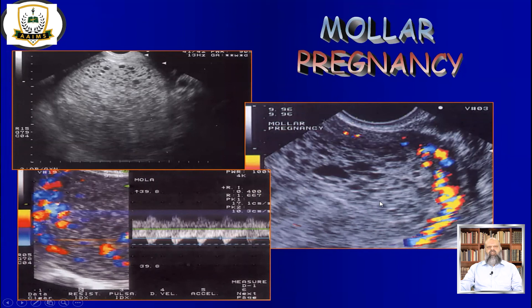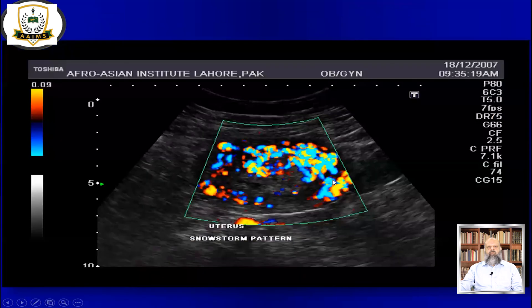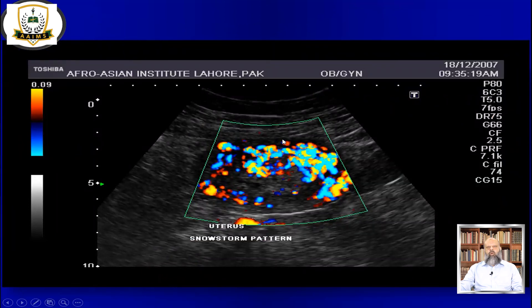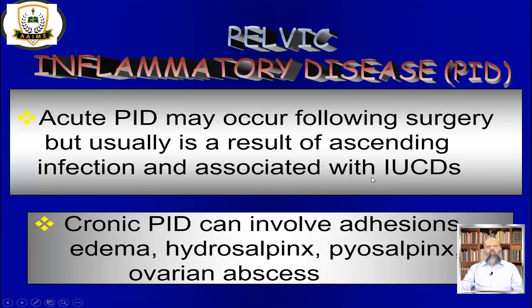In molar pregnancy, there will be a snowstorm appearance on grayscale. On color Doppler, the mole compresses vessels, increasing their velocity. The resistive index is 0.400. This is another case showing the snowstorm appearance characteristic of molar pregnancy.